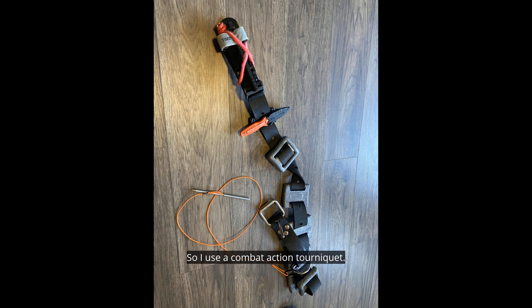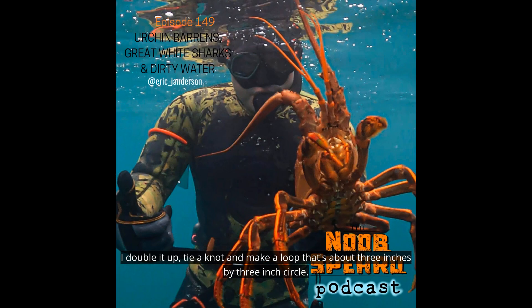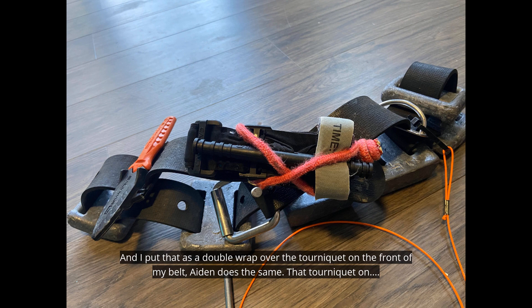So I use a combat action tourniquet. I attach it to the front of my dive belt, and it's a pretty foolproof system — I've only had it come off one time in probably 100 dives. I take a piece of bungee cord and make a loop, double it up, tie a knot, and make a loop that's about a three-inch by three-inch circle. I put that as a double wrap over the tourniquet on the front of my belt.